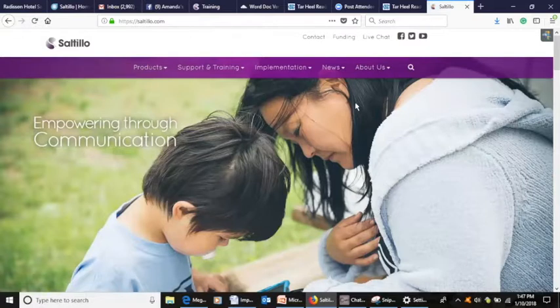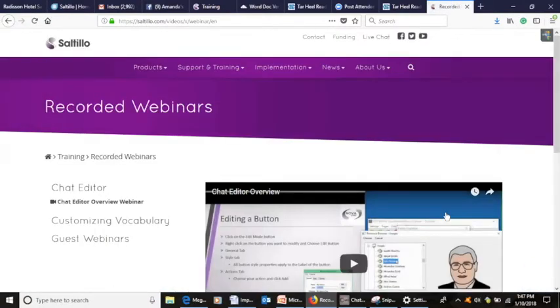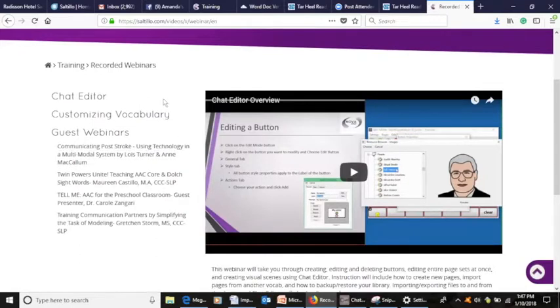Yeah, so this is Saltillo's website. If you go to Support and Trainings, and you go to Recorded Webinars and the Guest Webinars, so the ones that we have up here, the one I was talking about was this one right here, Training Communication Partners by Simplifying the Task of Modeling. And that's really what she does. She gets the paraprofessional who's with the kid all day to learn the device.